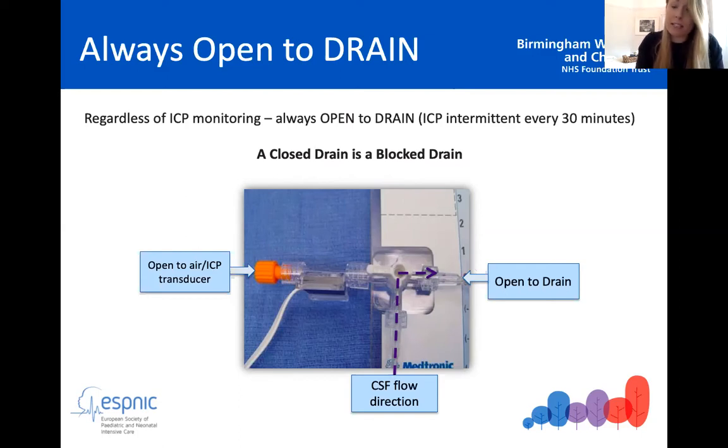We can get the EVD draining again, and we don't need to escalate to the neurosurgeon. And that has been really important in not overloading neurosurgeons with tons and tons of calls that they then come for and feel they didn't need to come for, because we could have fixed them. And so having this system in place has given a lot more confidence to the bedside staff to be able to troubleshoot most of these problems and keep the EVDs draining.